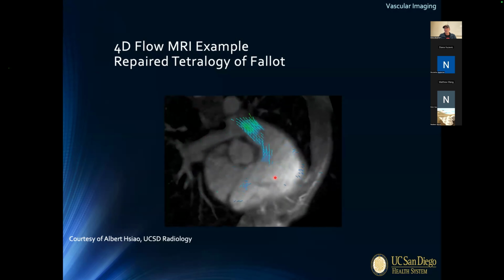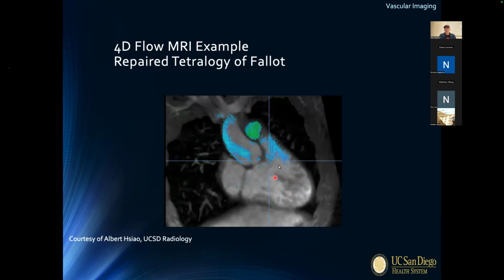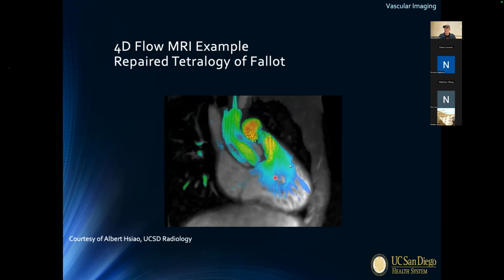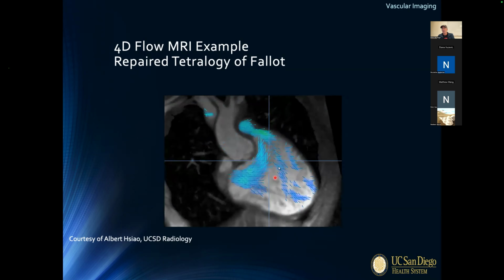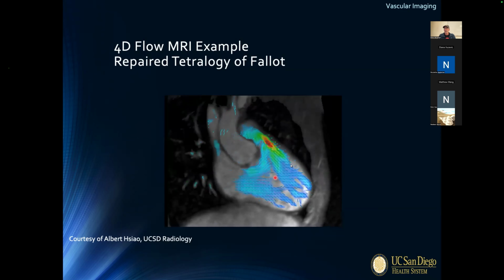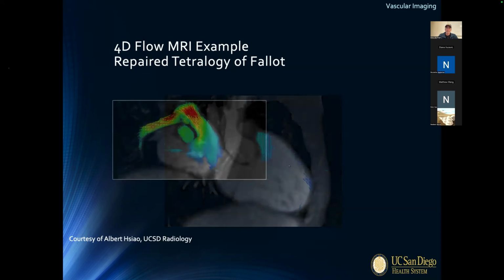And just the fact that the acquisition takes so long, the state of the patient can change over time, in that when they go in, they might be fine with a pretty constant heartbeat of 61. And then by the time you're done, they're quite anxious and their heartbeat's 78 or something like that. So just how stable the patient is over time is also a factor as to how this turns out.